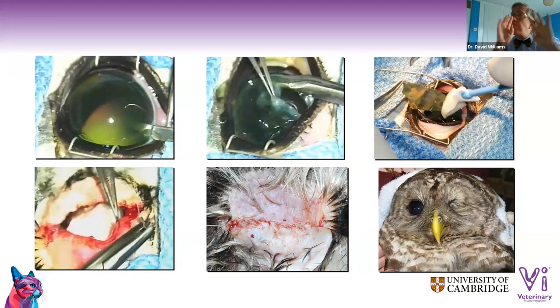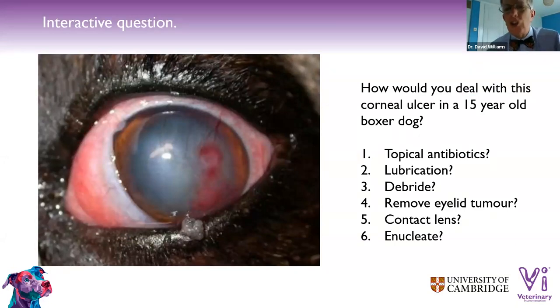What I would say, if you're doing a bird of prey like an owl, removing the eye really destabilizes it. So here is where I would eviscerate the eye. As you can see here, we've cut into it on the left there. We've opened it up with a pair of corneal scissors, then scooped out the inside of the eye with one of these spears, a friend of mine calls them Britney Spears. Then we put in some foam cellulose padding and close it up, and that works out perfectly. So I would say eviscerate owls, but don't eviscerate dogs. It's quick.